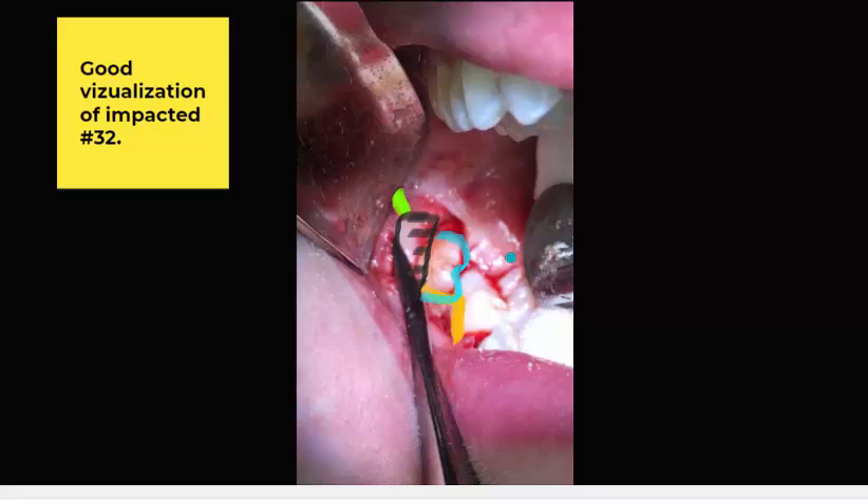The beauty of this design is that I don't traditionally use sutures in my third molar cases. If I have passive tissue repositioning to a pre-surgical position, I don't use sutures. These things will lay passively in place, and I traditionally don't use sutures. This is the reason I use this flap, and it works well for me.